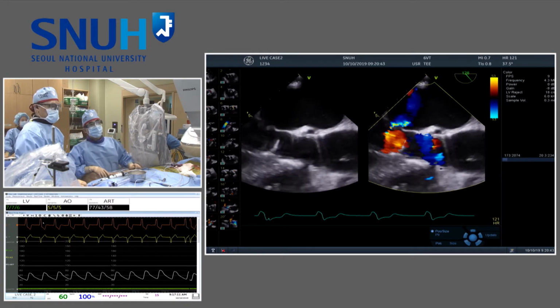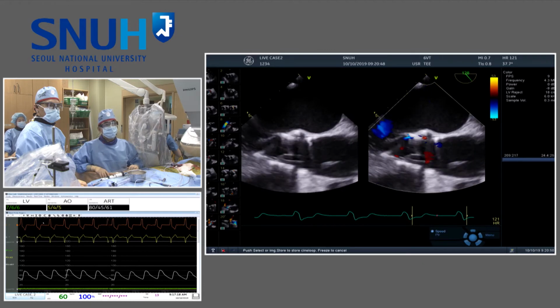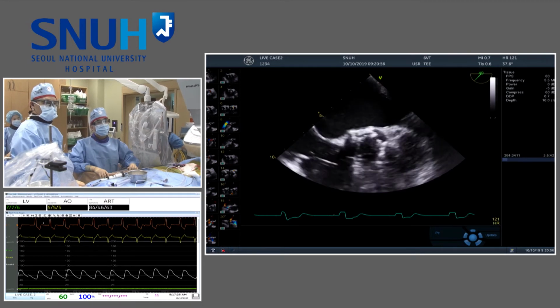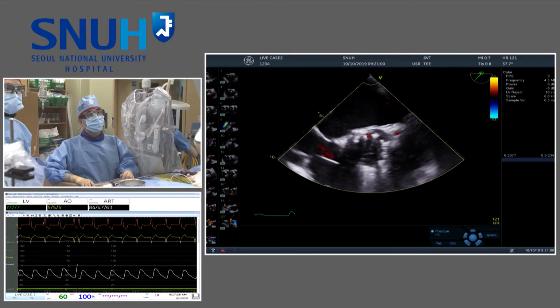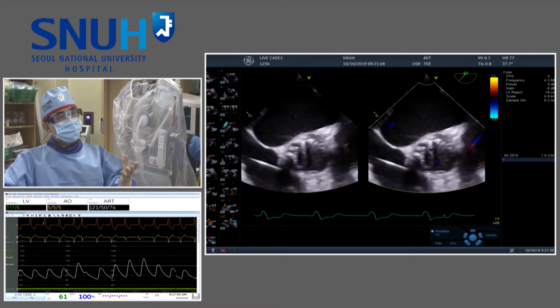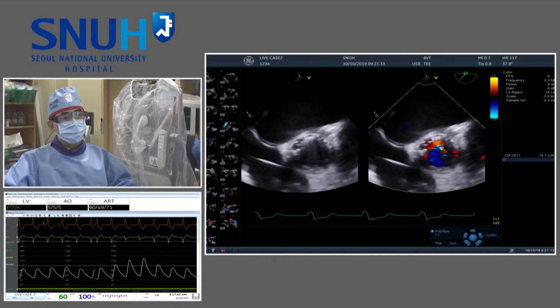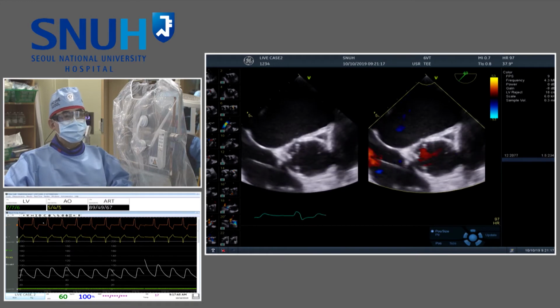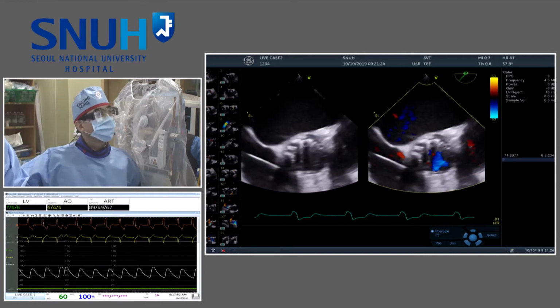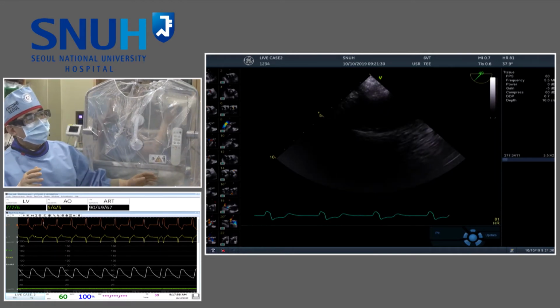Can you see the TEE? So longitudinal view, we cannot see a significant leakage because oversizing index is about 8%. Short axis view. Color. So no probable leakage. So I think oversizing index is always very important. Bigger, less leakage, in spite of higher risk of complication, tear. Dr. Kim, can you show us the hemodynamics with the pigtail in the ventricle and the aorta simultaneously? It's extremely important here. Okay, I confirm there is no leakage.